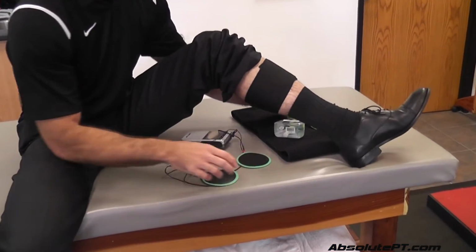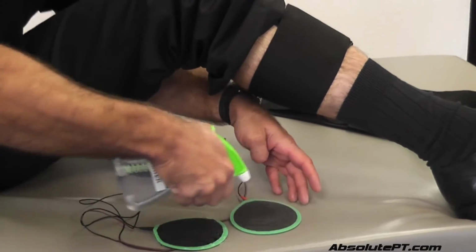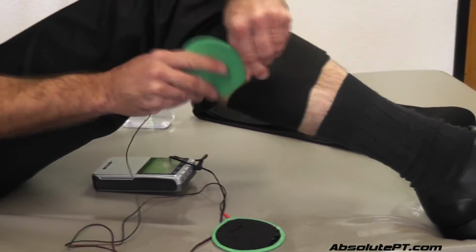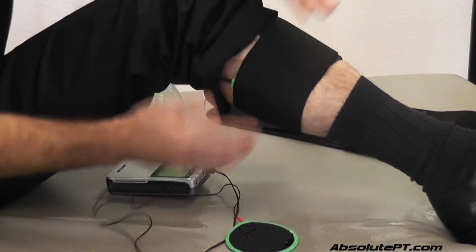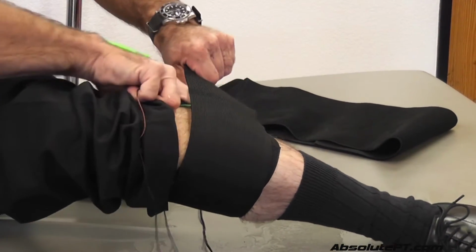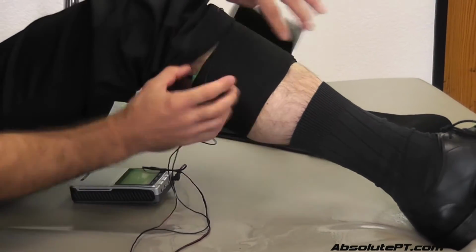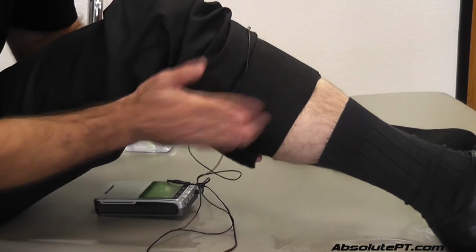Boom. I will spray my pads, make them dripping wet. Then without dumping the water off, I stick them over the main part of my muscle belly that I'm interested in contracting. I had these straps custom made from China so they would cover up the full diameter of the pad. I want good contact. Good contact doesn't sting.